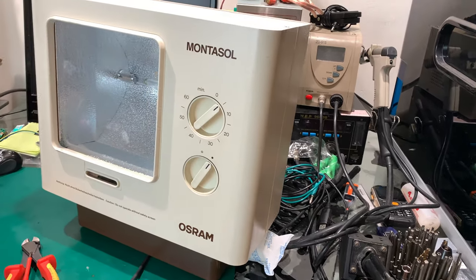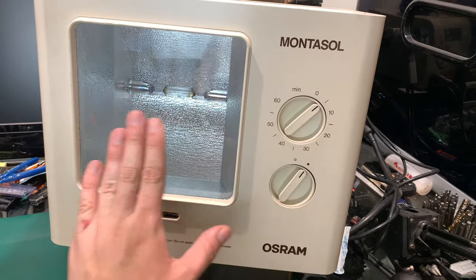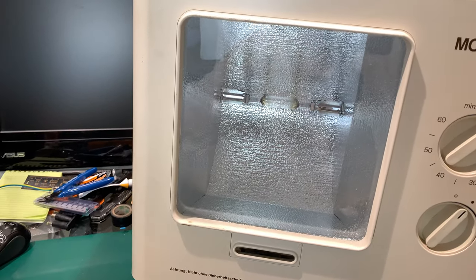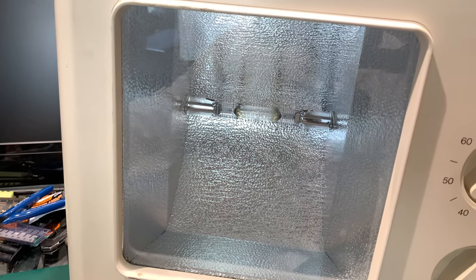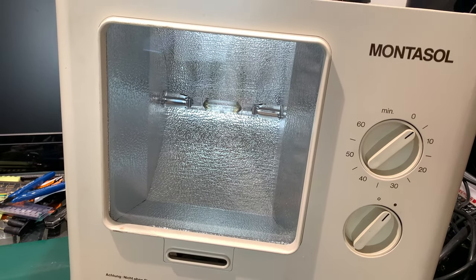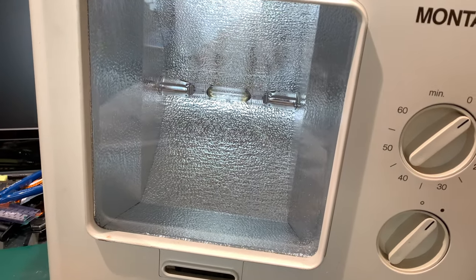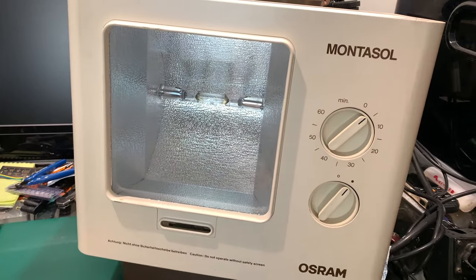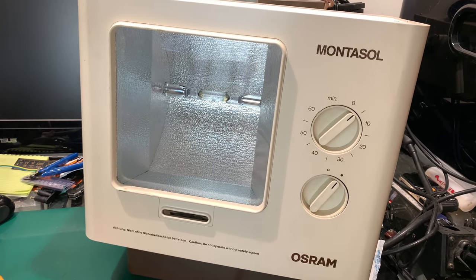So you can get some artificial sun - absolutely beefy unit. And it wasn't working. Let me turn it on and take a look at the bulb. You can very briefly see the spark - maybe that's the ionization, maybe that's the right word - but it doesn't work as I expect. I expect a problem with the starting circuitry.